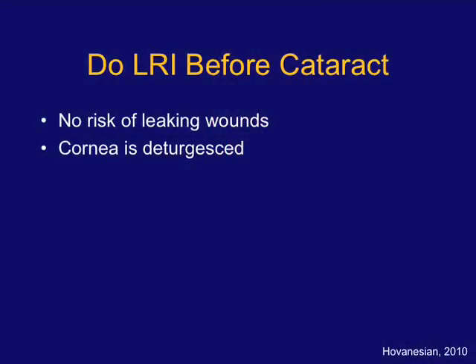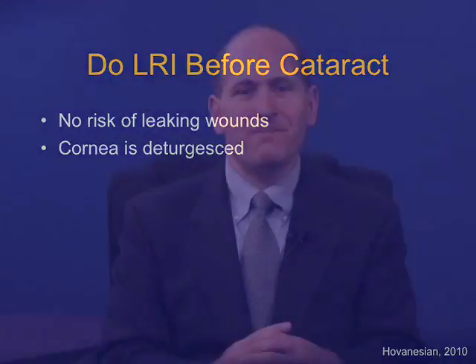Like most surgeons, I prefer to do LRIs before I do the cataract procedure for a couple of reasons. First, there are no incisions to leak, and second, the cornea has not yet been hydrated. I use a Mendez marker, lining it up so the horizontal and the vertical hash marks line up with the ink marks that were just made in the pre-op area. This way we know the axis of our incisions will be correct.